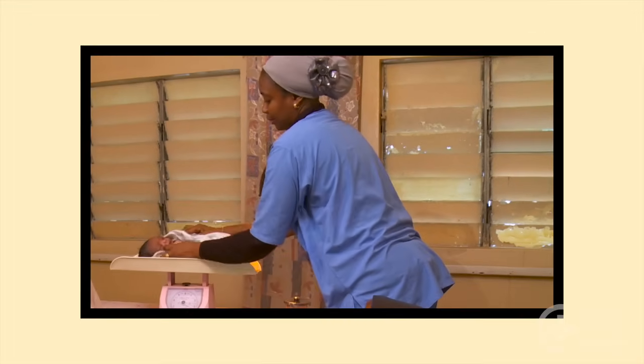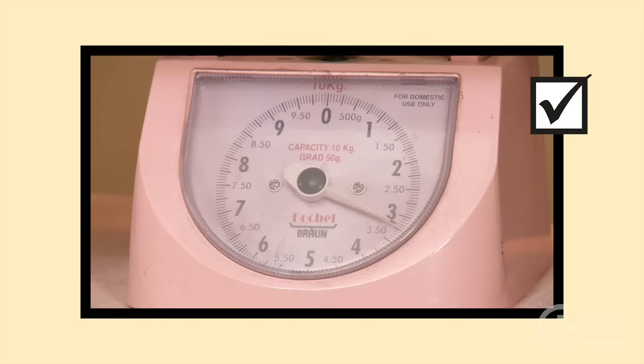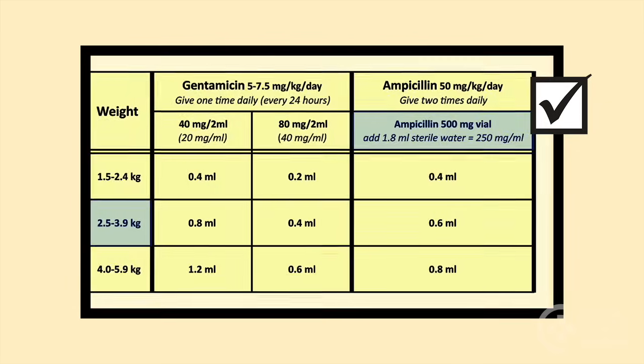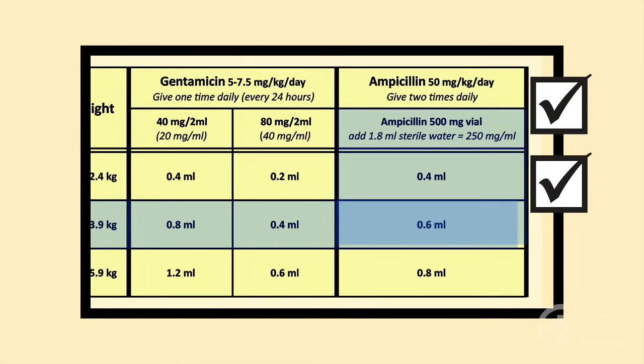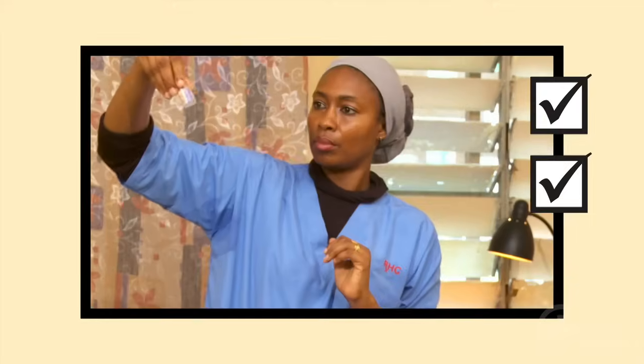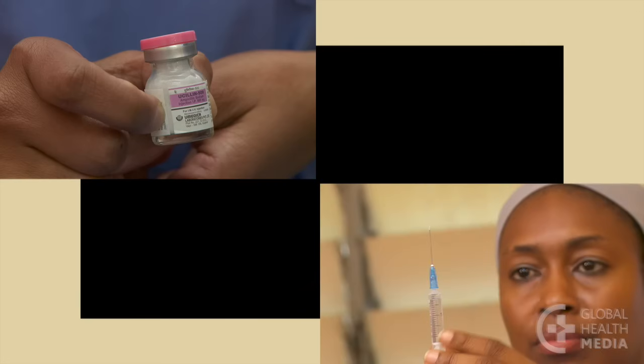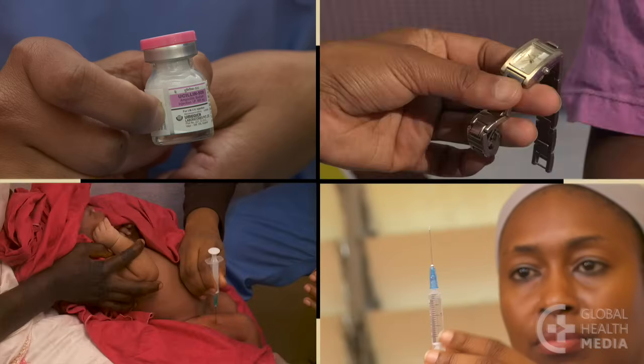Remember, an accurate weight will ensure an accurate dose for the sick baby. Use a dosage chart to save time and reduce math errors. Follow the five rights of medicine usage: give the right medicine, at the right dose, by the right route, at the right time, to the right baby.